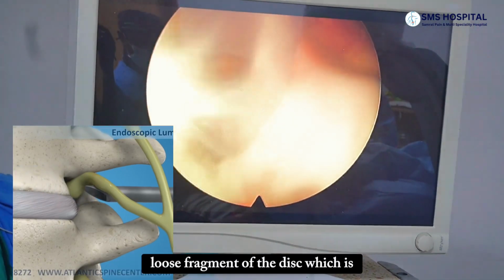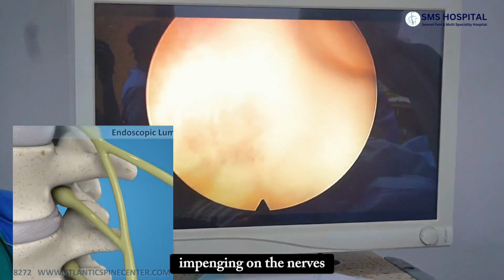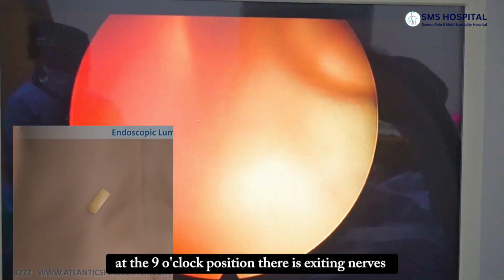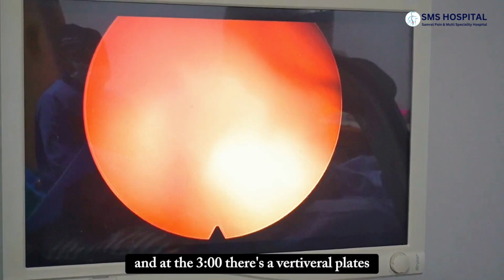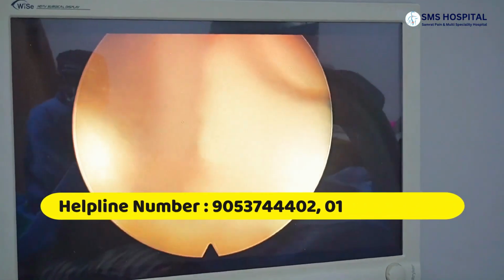We can say this white structure is clearly a loose fragment of the disc which is impinging on the nerves. At the 12 o'clock position there is the thecal sac. At the 9 o'clock position there is the exiting nerve, at the 6 o'clock there is the disc, and at the 3 o'clock there is the vertebral plate.